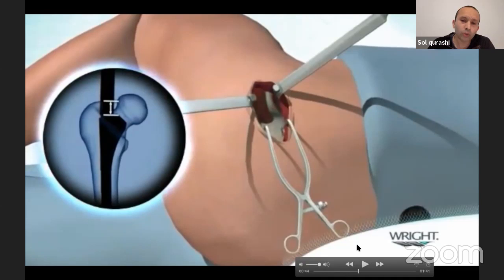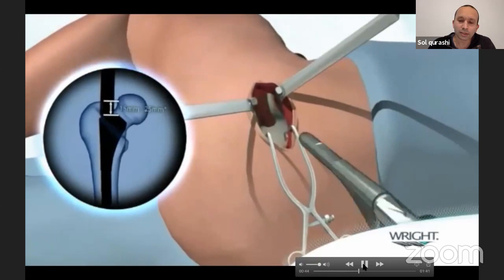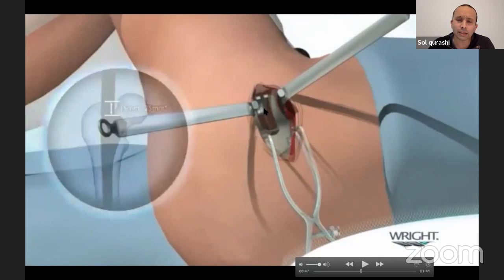What I also do, once I've gotten to the stem size that I'm happy with, then I also get a quick x-ray shot as well, just to make sure that I've got a nice tight fill. I know where the stem is, but obviously I don't know how tight the fill is, and that image gives me a lot of reassurance that it's not going to subside. So you broach, then you leave the broach in. There's your broach of your desired size in, you leave that in. And you use that as an intramedullary guide to neck resection. So you'll put the saw here on top of the broach and you'll cut the front, the back, and the medial calcar.